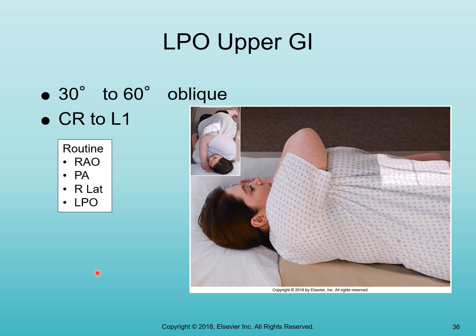The technique on an LPO is 110 kVp at 2 mAs for a single, 90 kVp at 2 mAs for double or water soluble. Kind of interesting that so far most of the things we've talked about with regard to fluoro studies on the APs, it's been 110 at 2, and I will tell you the laterals are typically 110 at 4, or dropping the kVp for double or water soluble.